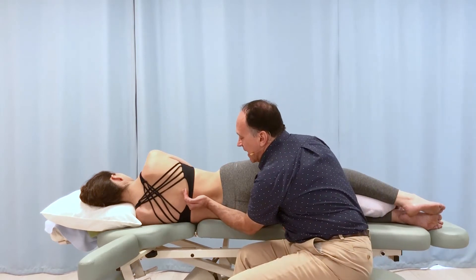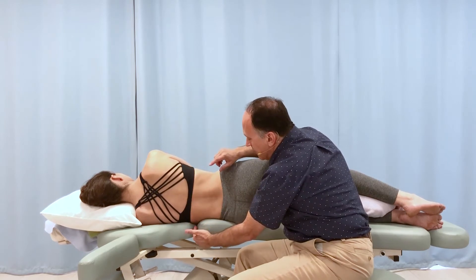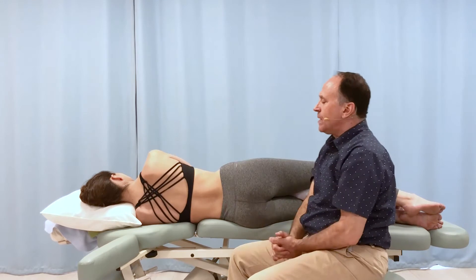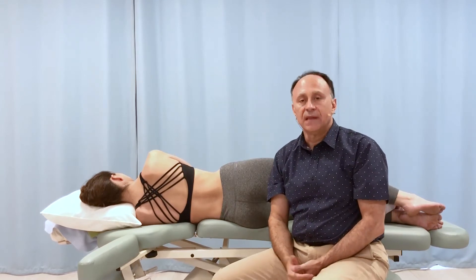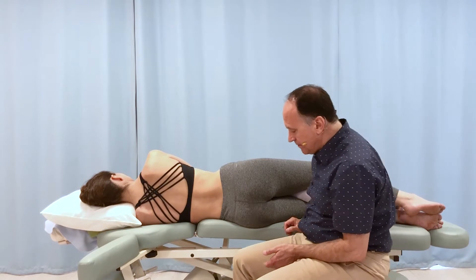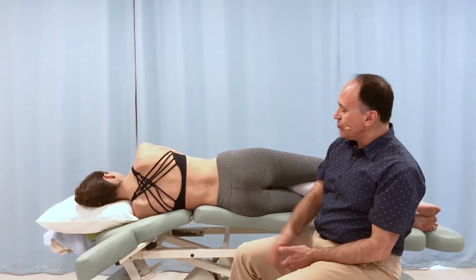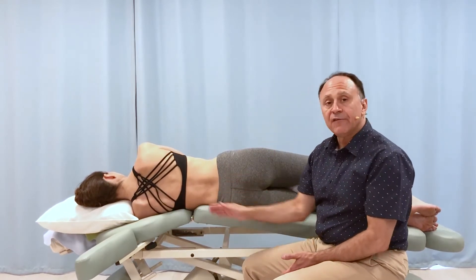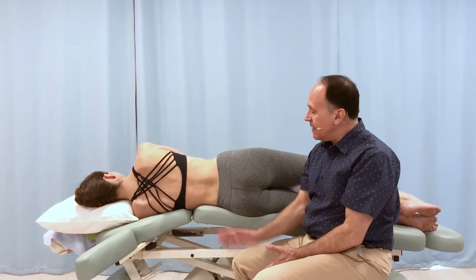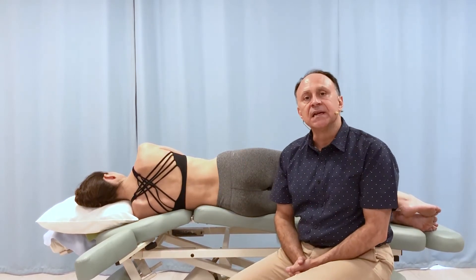If we have a curve of right lateral flexion, what we would want is to bring her at this break point in the table at the apex — around that point as a fulcrum point — into left lateral flexion. This is so much easier than working with bolsters because I can set the degree of left lateral flexion simply by a foot pedal. I let her stay here for 10 to 30 seconds and accommodate to it.